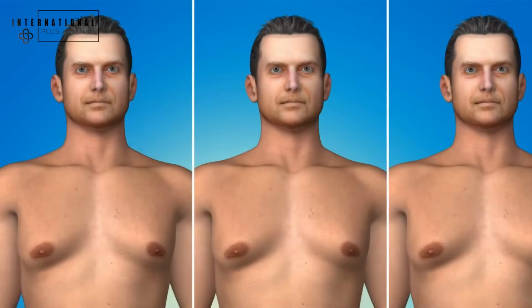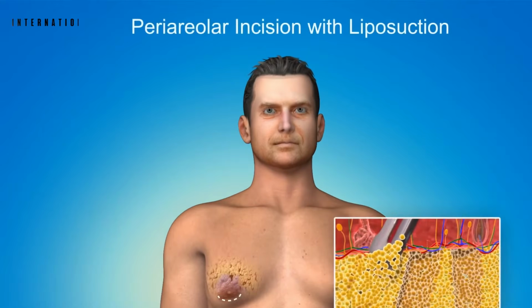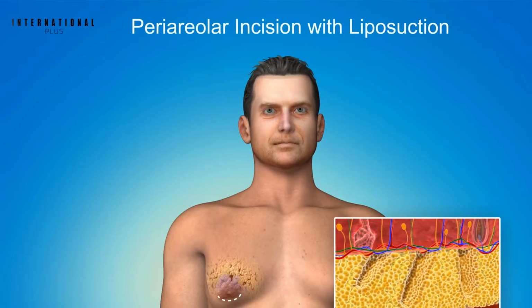If your surgeon chooses surgical resection, the type of incision used will depend upon your specific condition. Surgical approaches to resection include the periareolar incision, the donut incision or lift, and the anchor incision. This animation will demonstrate surgical resection of glandular tissue using the periareolar incision in combination with liposuction.